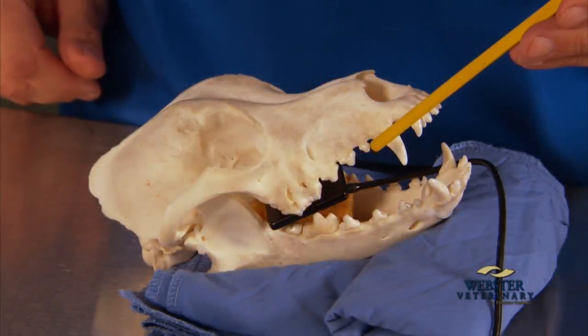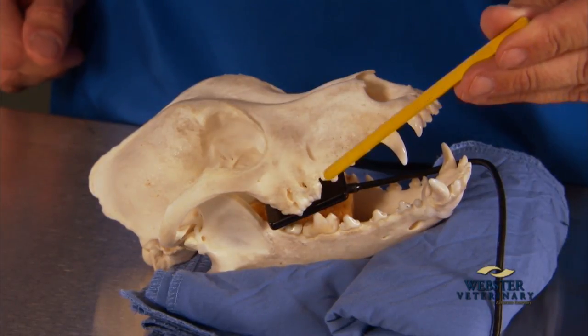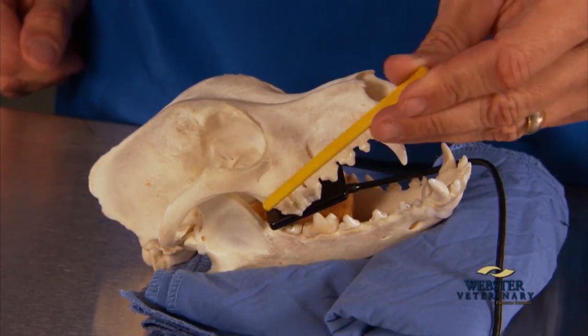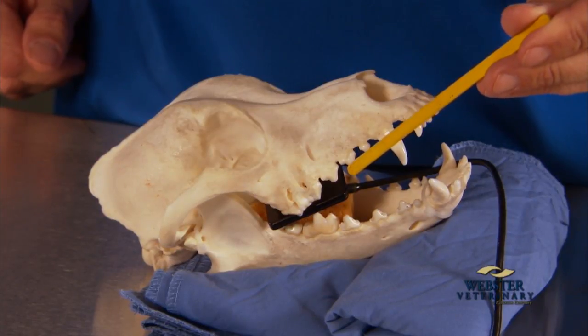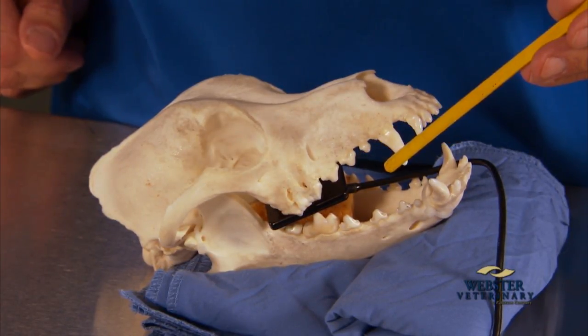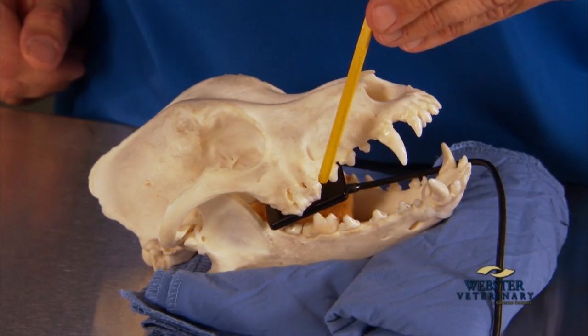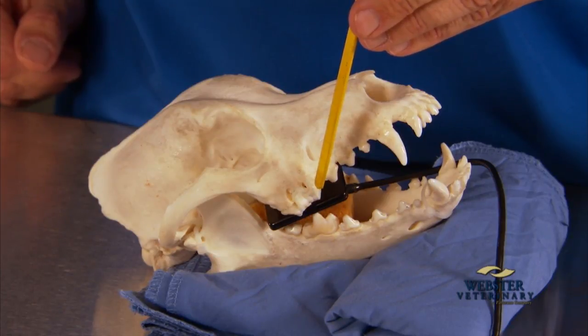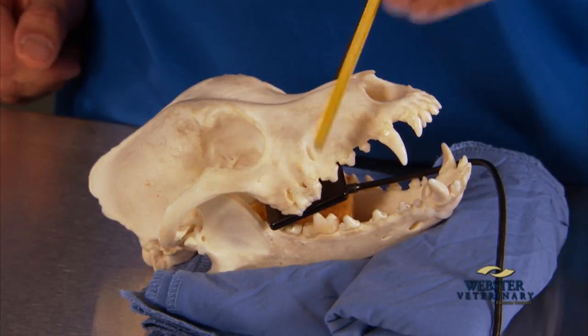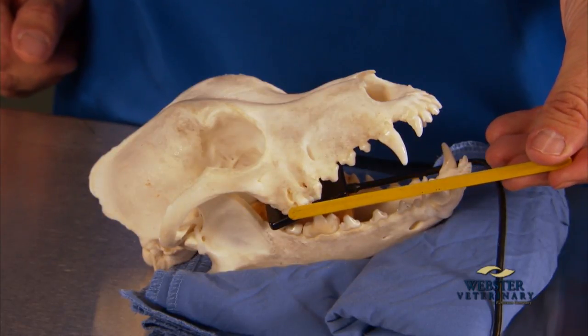In order to image the triple-rooted teeth of the maxilla, primarily the fourth premolar, although the first molar and second molar are triple-rooted teeth, it's important to learn the tube shift technique. The tube shift technique is primarily used to separate the mesial roots of the fourth premolar, which are superimposed over one another. The sensor is placed in the oral cavity in this position.